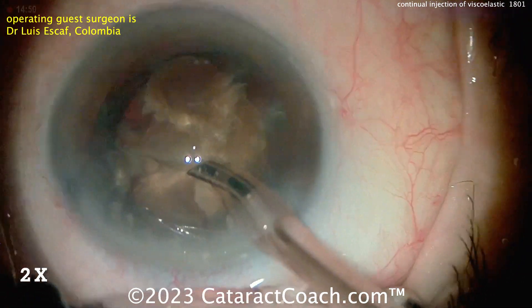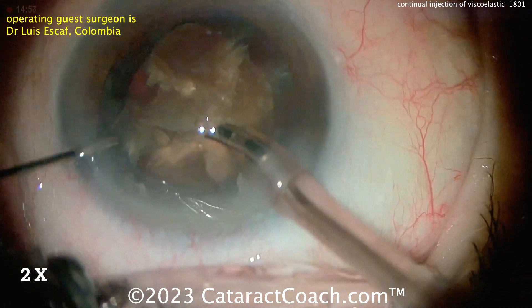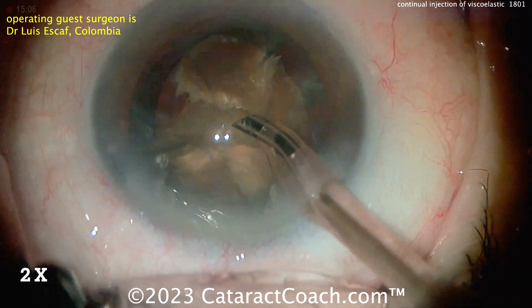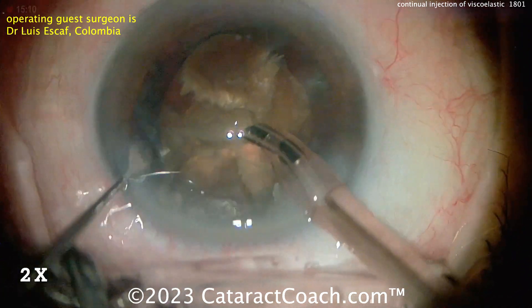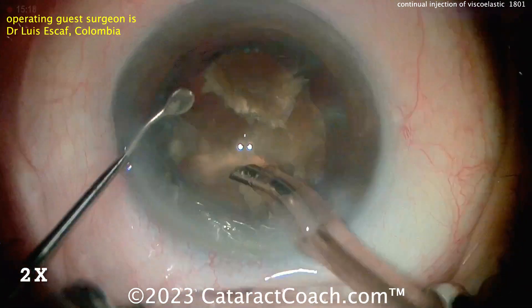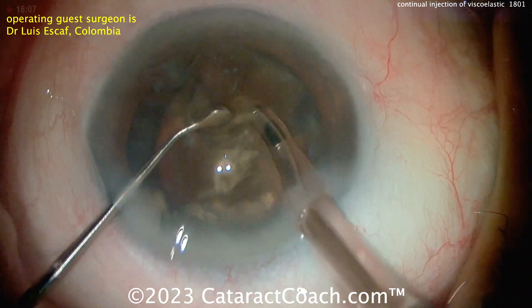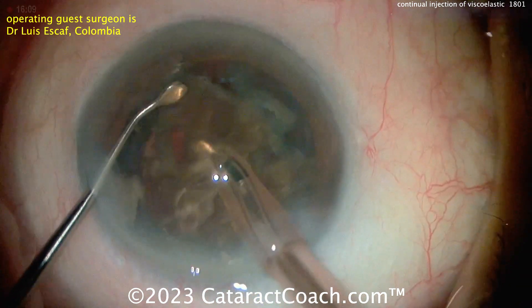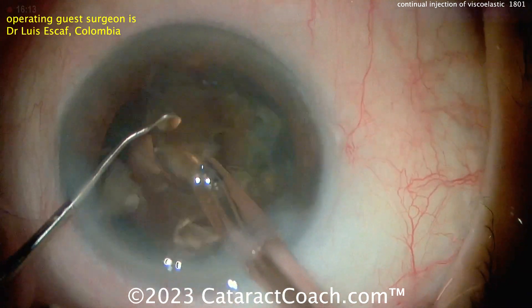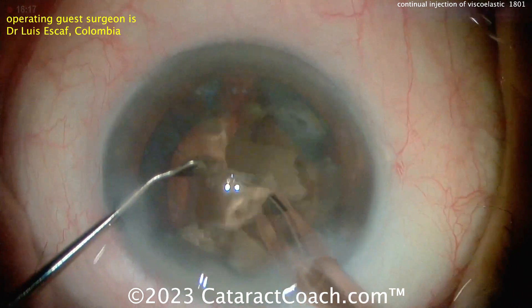So here the surgeon is breaking it up into pieces. And now look at this — this was brilliant, I thought. Having a dispersive viscoelastic, maybe something inexpensive like HPMC, hydroxypropylmethylcellulose, or you could use a fancier viscoelastic, but just to recoat. We've done the recoat before, but something I haven't done is just continual injection of viscoelastic during the removal of the last few pieces of the nucleus. Pieces coming up nicely — that retina back there saying, thank you, let there be light.